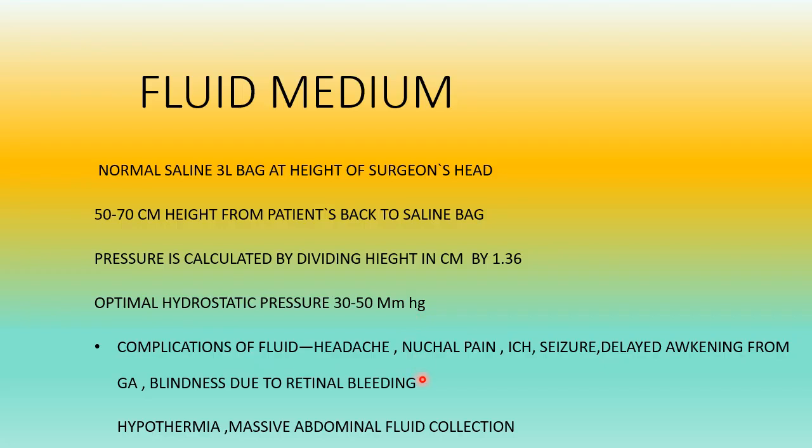The complications of fluid, you all know, it may cause headache, nuchal pain, intracranial hemorrhage, seizure, delayed awakening. Blindness may be possible, but hypothermia is common for initial cases, and sometimes massive abdominal fluid collection if you injure the fascia.